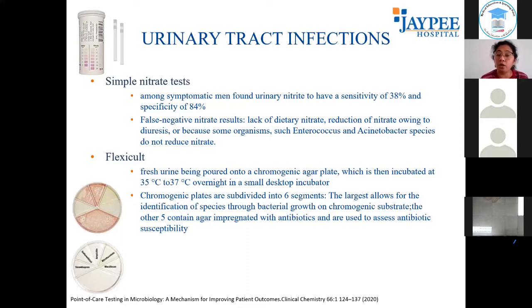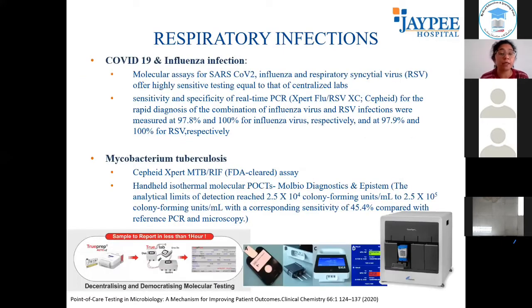Though this has not got FDA approval, I thought it was a very novel idea for urine culture to be made easy, to be made accessible to locations where you do not have the technical expertise to interpret it. A microbiologist is not there everywhere. This may be an option, but yes, more work still needs to be done.